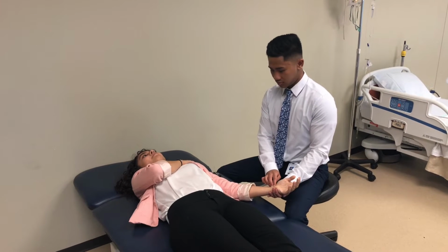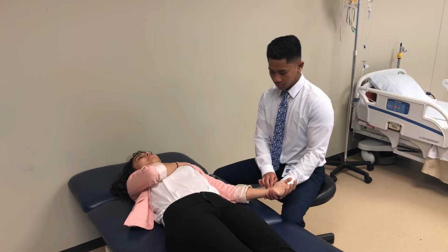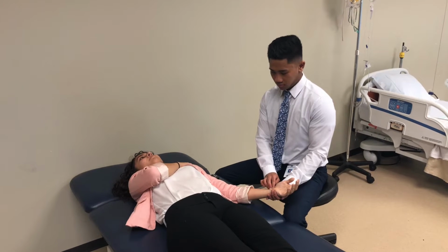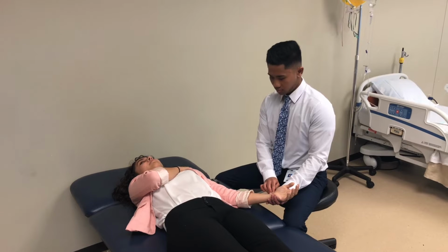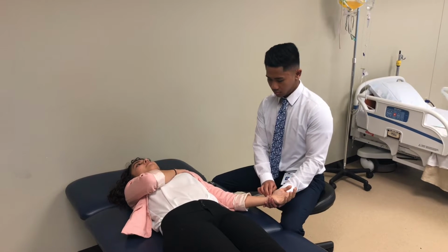You tell the patient you'll be checking their pulse, since you do not want them to know you're checking their breathing. Respiration patterns can change if the patient is conscious of their own breathing. The therapist counts the number of times the chest rises for 30 seconds.